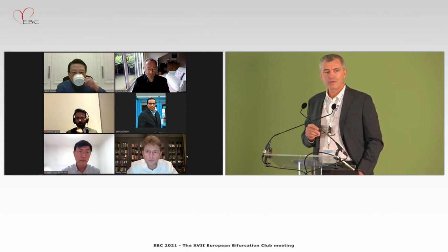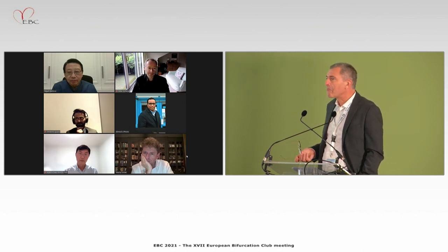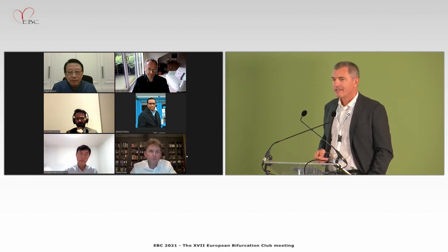Thank you very much. Effectively, the simplest technique is to cover the perforation with a covered stent, but you didn't have one. The oldest will remember the old perfusion balloon we had 25 or I don't know how many years ago, and it does not exist anymore, I think. Right? Yeah, they still have it in Japan? None in Europe. Questions or comments?